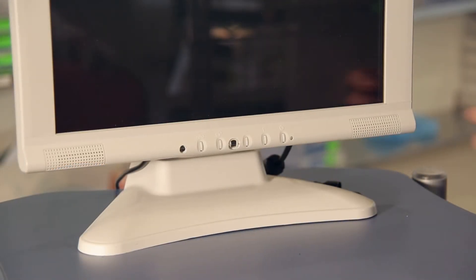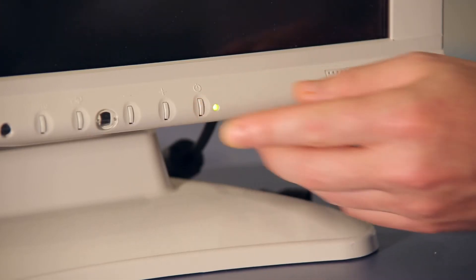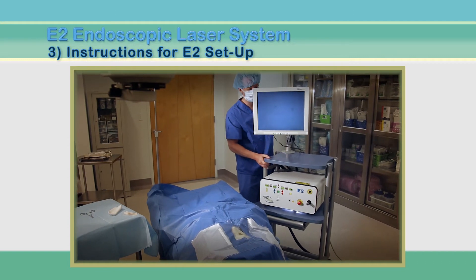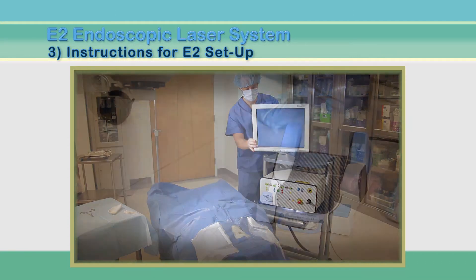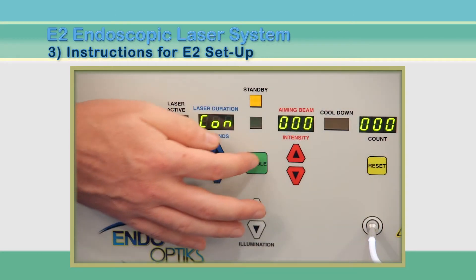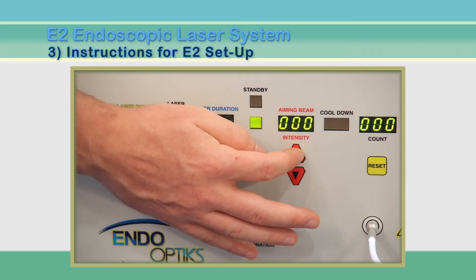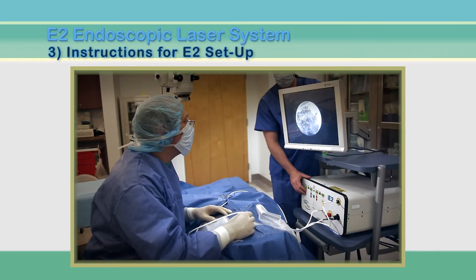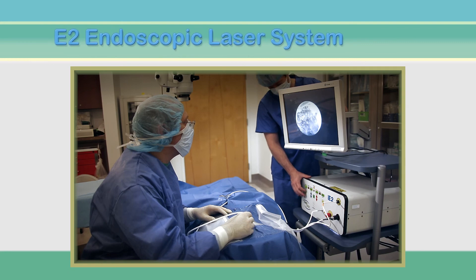And finally, the monitor should be turned on. After initial setup, it should only take one to two minutes prior to surgery to move the unit into position, place the foot switch, connect the endoscope, and set the system parameters. In many ORs when ECP is being performed in combination with cataract surgery, the unit is set up while the cataract procedure is progressing.